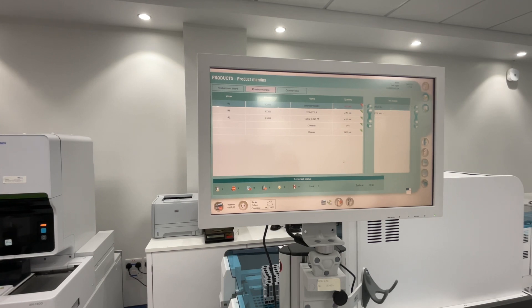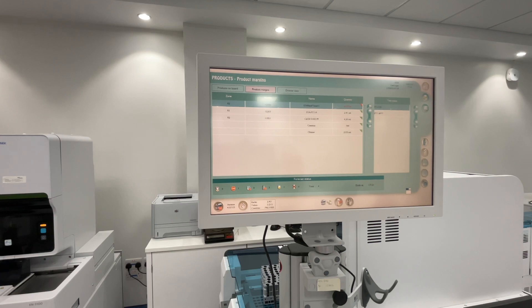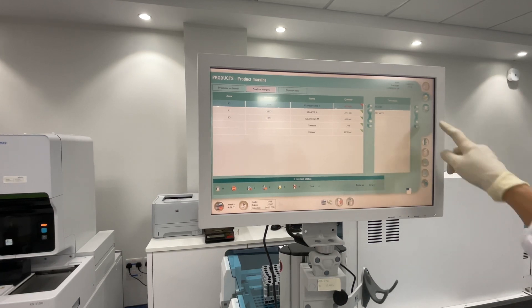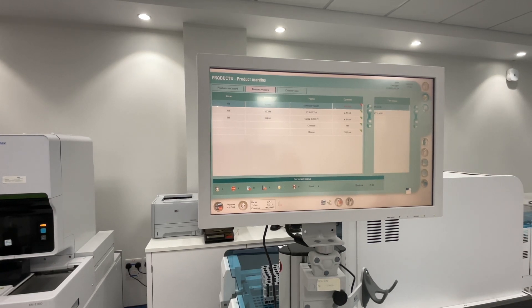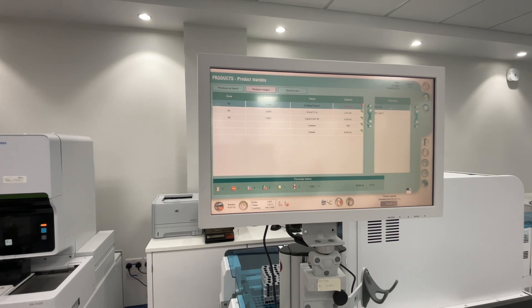The reagent is needed for PT and INR. You can click here on the reagent icon or click Open Reagent. You will see a wait time - you have to wait four minutes for the drawer to open.